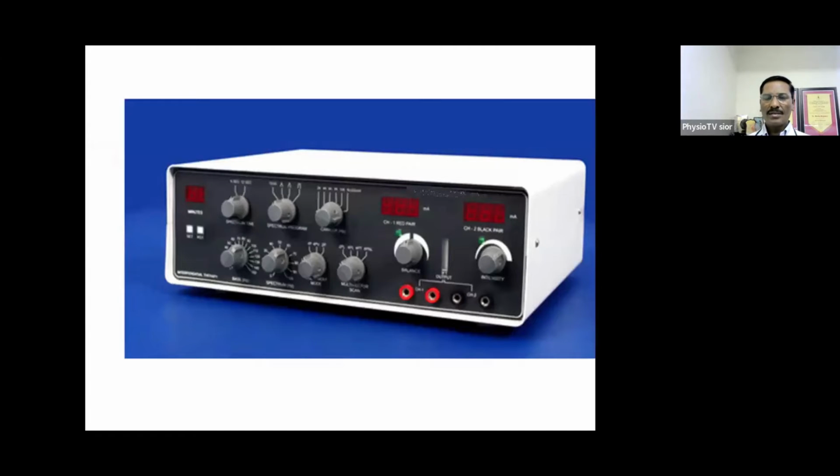So let us first start with the basic layout of the IFT machine. Basically, it contains the following units. On the left-hand side, we have the timer. Then after the timer, we have a knob to select 2000 Hertz and 4000 Hertz. It may or may not be present in all the machines. In most of the machines, they have 4000 mode as default. That means 4000 frequency is fixed, whereas 2000 may or may not be present.